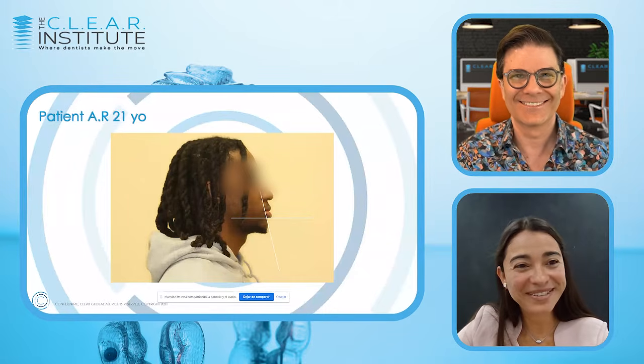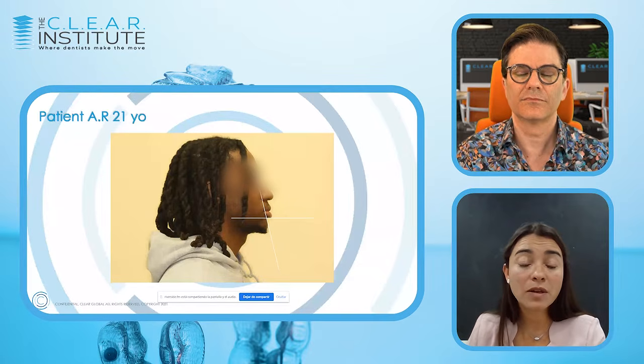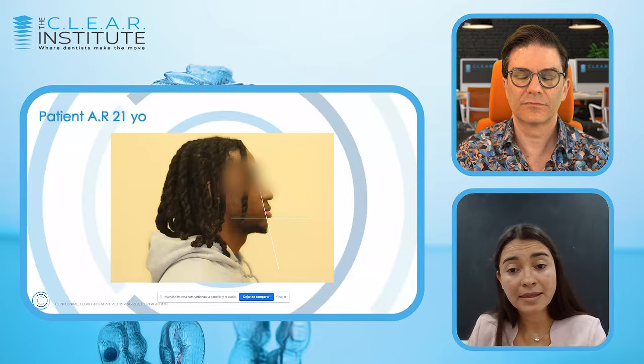That's good. Absolutely. So with Andrew, when we do the mentolabial angle, we can see that it is a very generous angle for him because of the characteristics of his lips. And for most patients, we can have a good idea of how the lower incisors are positioned within the mandible when we look at this angle.